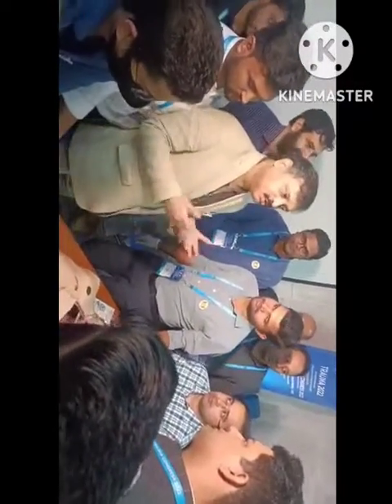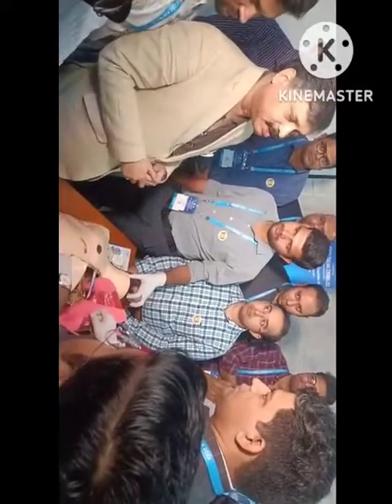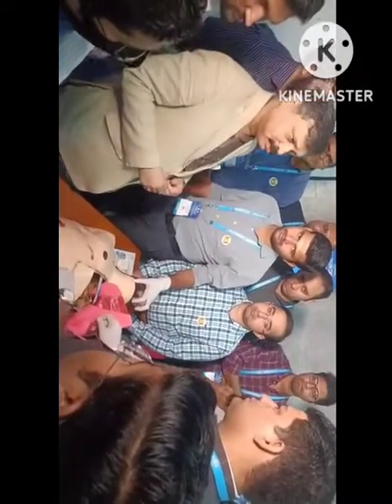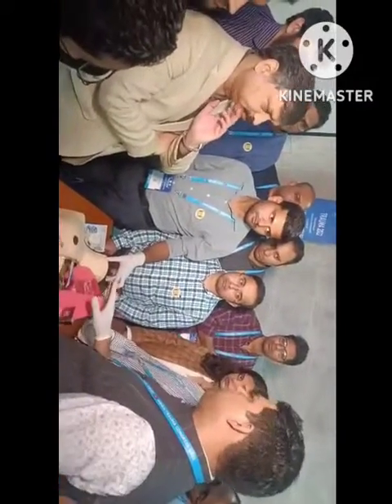So how do you clamp the aorta? What lies with the aorta? The esophagus. And because the whole blood is drained, it will not be a juicy aorta; it will be collapsed. So how will you identify that you are clamping the aorta only? First, I will tell my assistant or whoever is available, please put an RT. That is the best method.